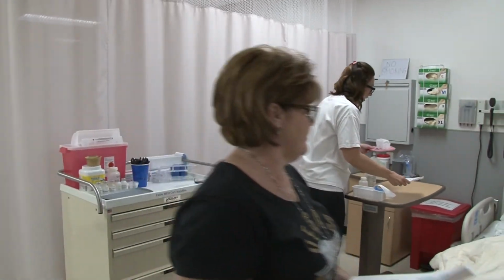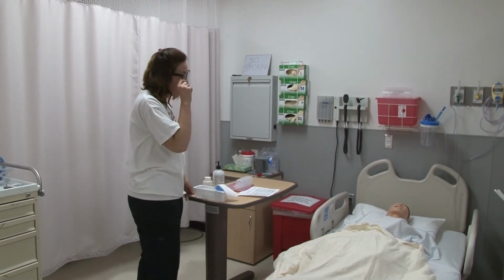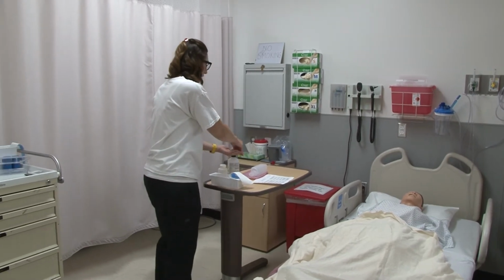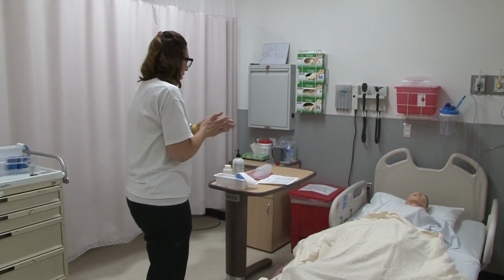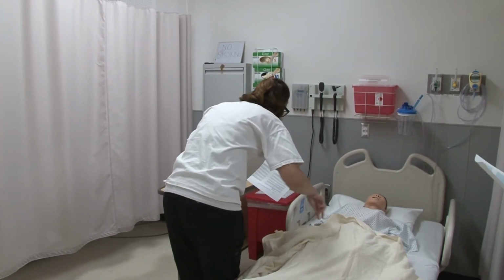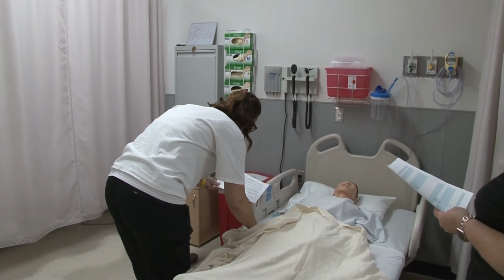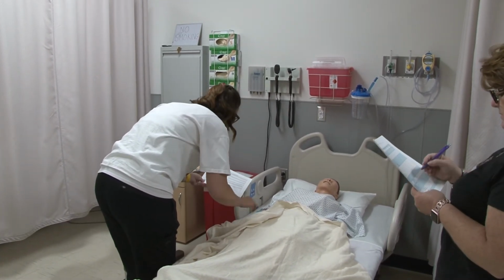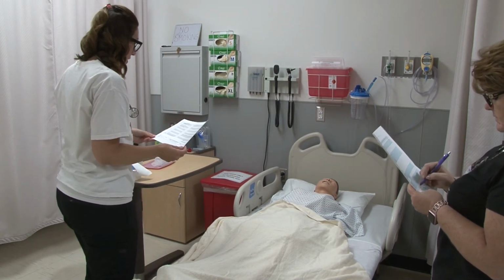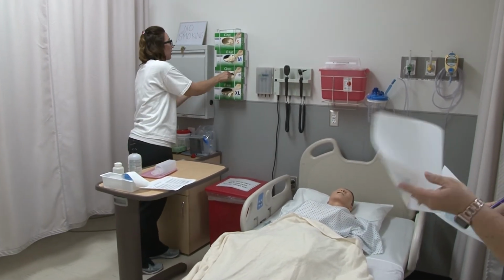Knock, knock, knock. Good morning. Hi, my name is Lisa. I'm a nursing student with UNLV, and I'm here to administer your morning meds. How are you doing this morning? Good. Okay, before we begin, can you please verify your name and date of birth for me? Steve Rogers, 7/4/1941. Very good. Mr. Rogers, do you have any allergies? No allergies? Okay. Great. I'm going to go ahead and lay that there and apply some gloves.